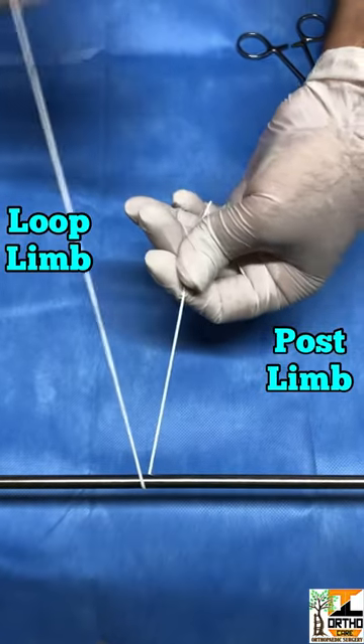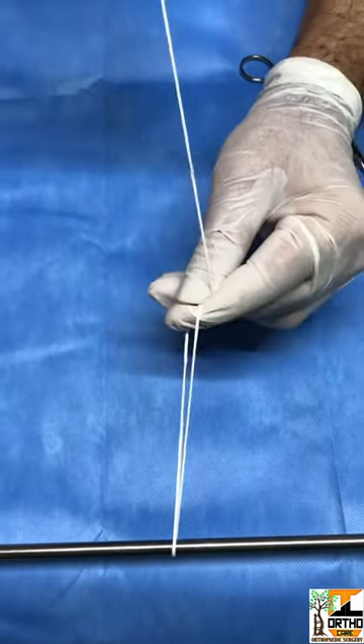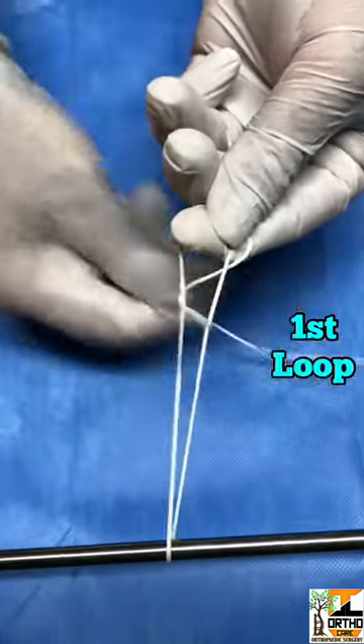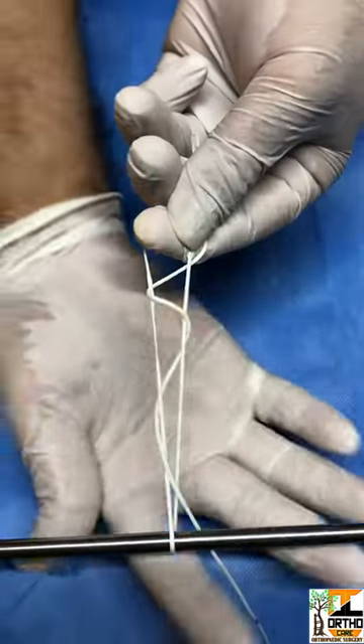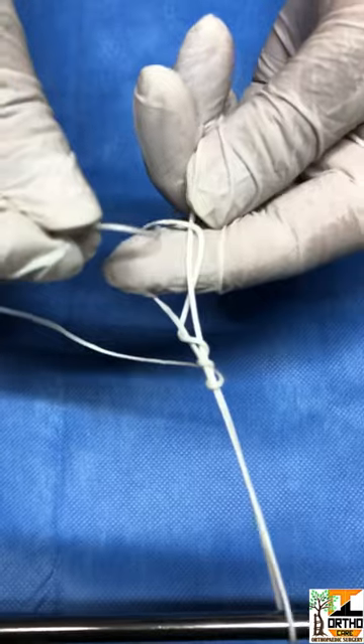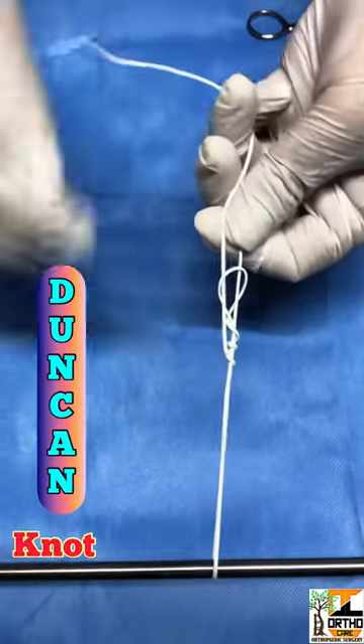Shorter post limb, longer loop limb — just hold a pinch first. Then the loop limb is rolled over both limbs: one, two, and three loops. Take the end and insert it into the pinched loop. Just hold it and rearrange the knot.